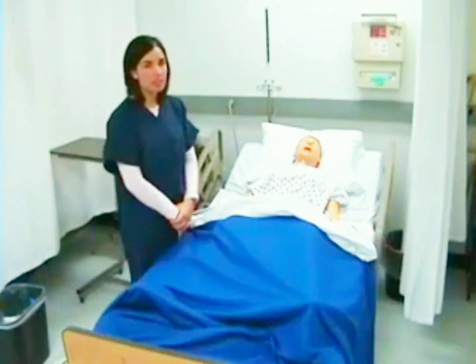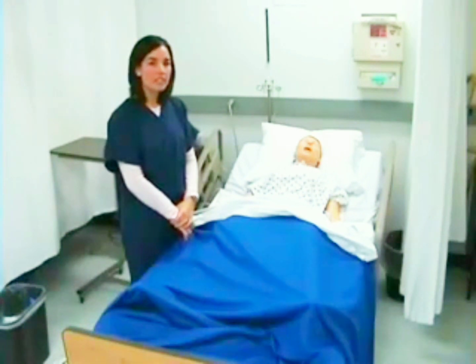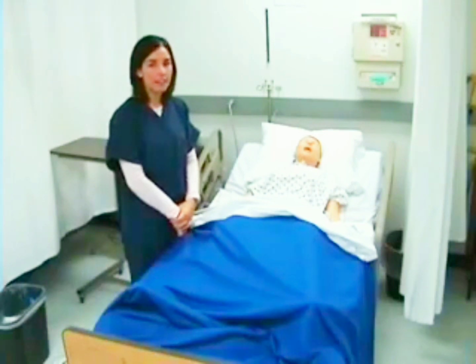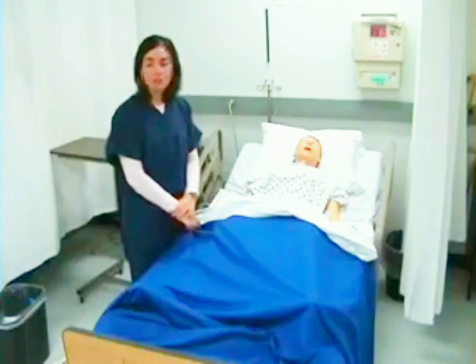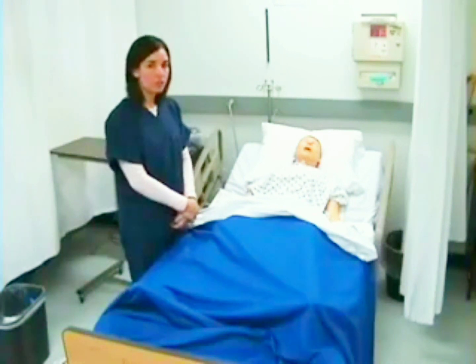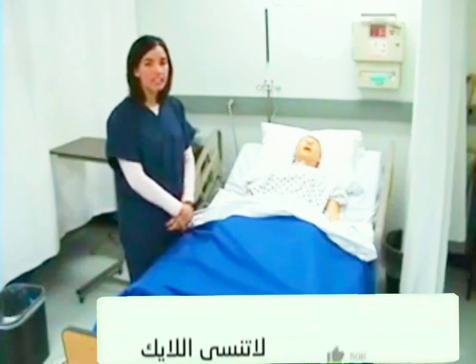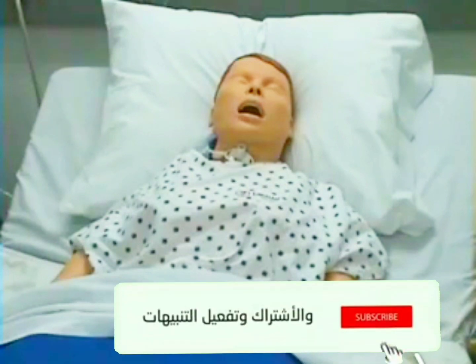This is the information that you need to document. On the nurse's notes and the I&O record, you must document the amount of urine and the time that the Foley catheter was removed. Your patient must void within eight hours of removal of the catheter. Let your patient know that they need to use a hat or a urinal to measure their urine for their first void and that they need to let their nurse know so that we can verify that she can void on her own.